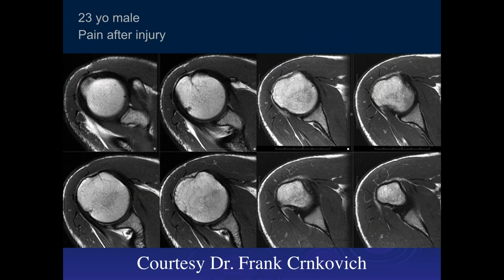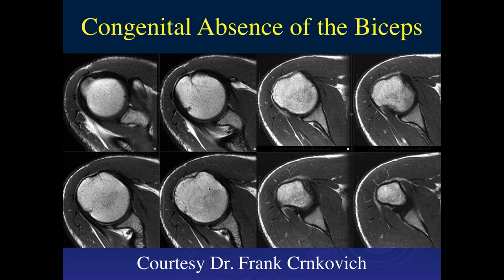Thomas, what do you think of this case — 23-year-old male with pain after injury? Looking at multiple axial shoulder views, there might be fluid in the region of the infraspinatus. This is another congenital absence of the biceps tendon. It's easy not to see it when it's not there. That's why it's important to have a checklist and always evaluate shoulder studies the same way every time, going through all the different structures.